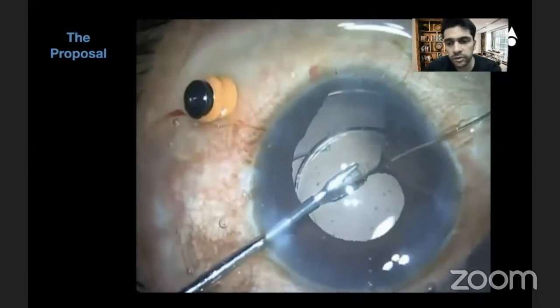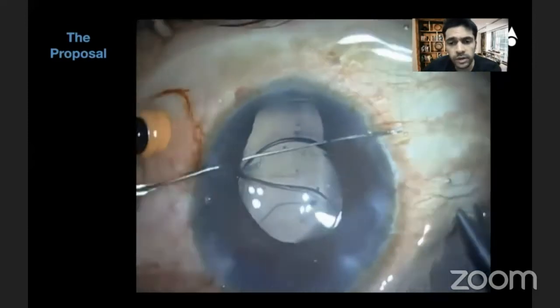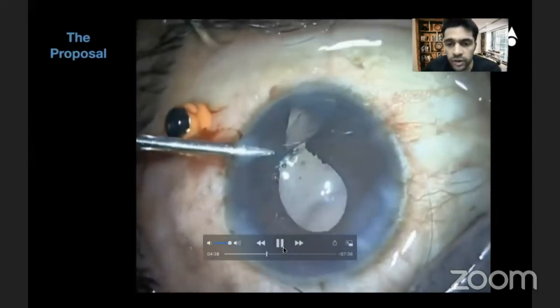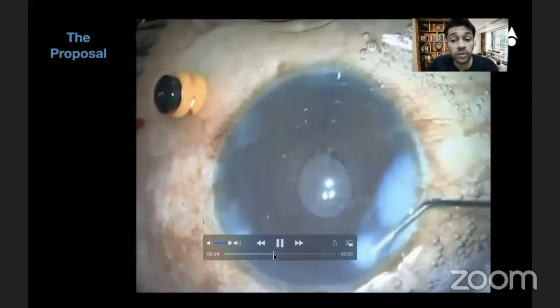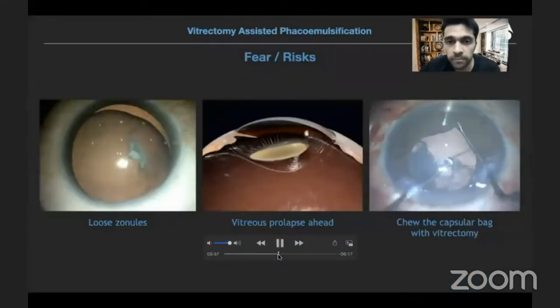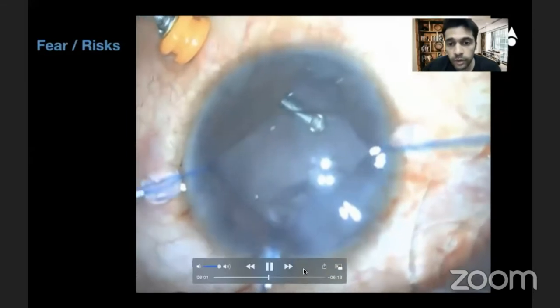In most cases I don't need to do this so often. Apart from that, in colobomatous cases I also close the iris defect with a single-pass four-throw pupilloplasty, giving me a really round, nice pupil. Watch — I'm passing the suture single pass from one side to the other.